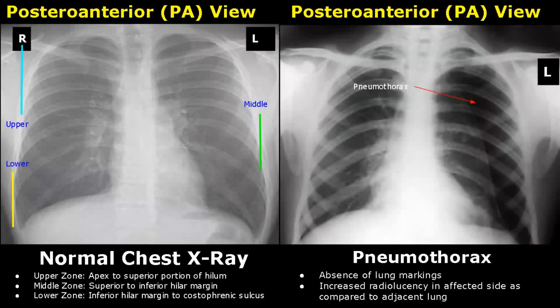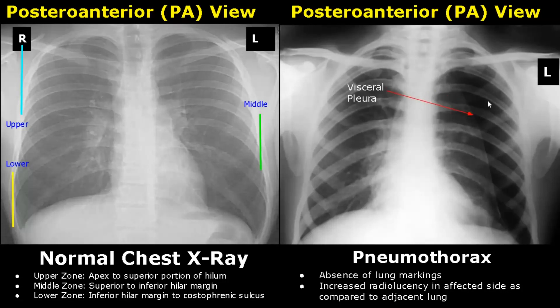Pneumothorax is defined as the presence of air in the pleural cavity. There will be absence of lung markings at the site of pneumothorax — we do not see any lung vessels here. Also, there is increased radiolucency on the affected side as compared to the adjacent lung; it is darker than usual. You can see a vertical line which represents the visceral pleura, seen in many cases of pneumothorax.